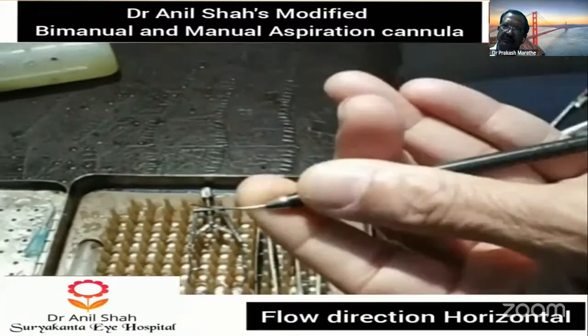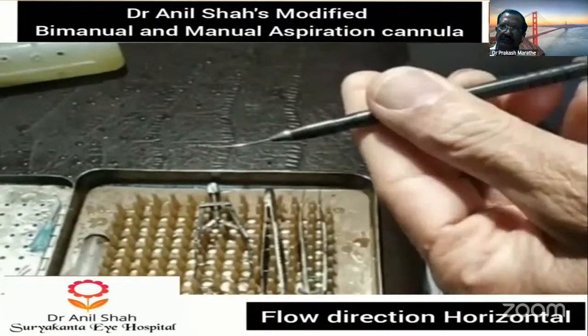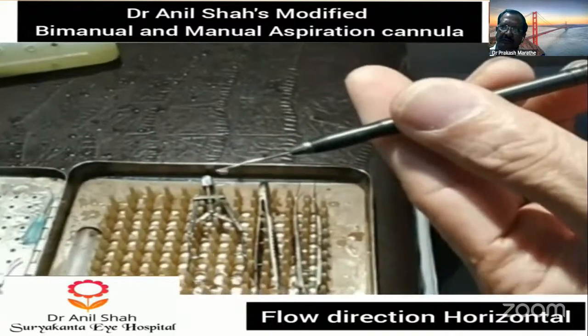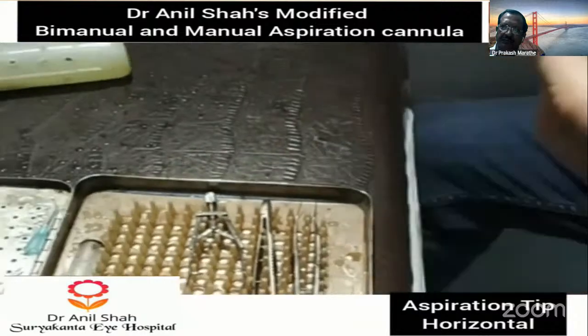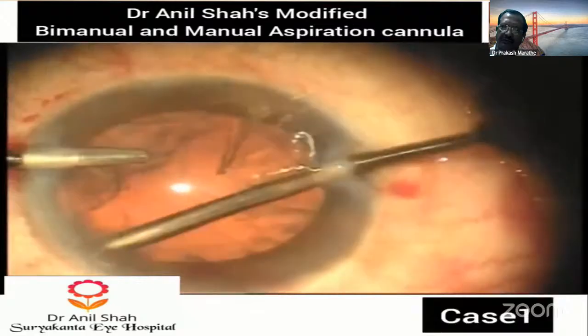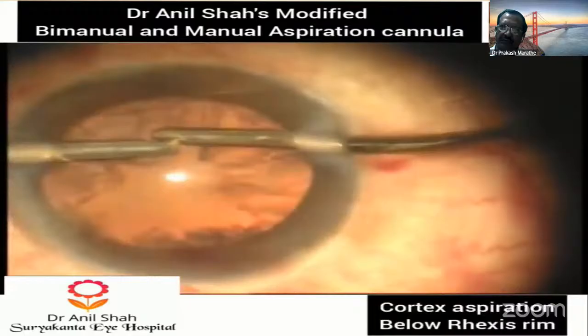Now here you will notice that the fluid is coming out horizontally. So the aspiration port is directed horizontally. Normally it is vertical aspiration, but it is directed horizontally. Now this horizontal aspiration cannula is passed into the anterior chamber.